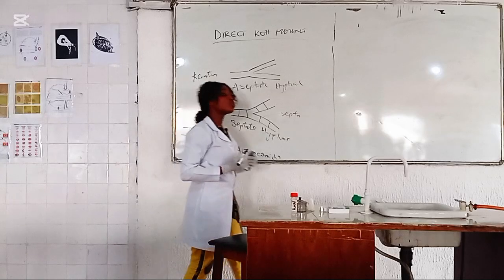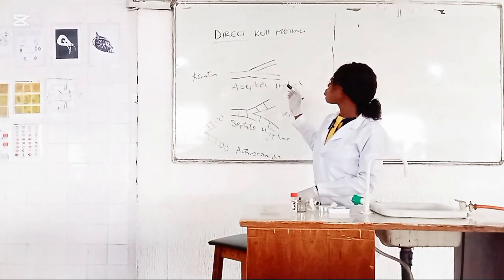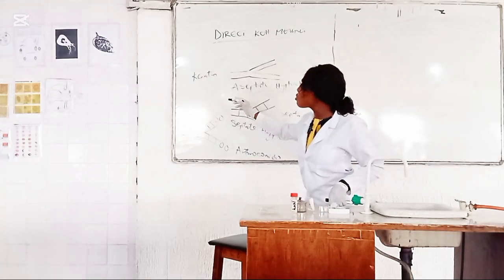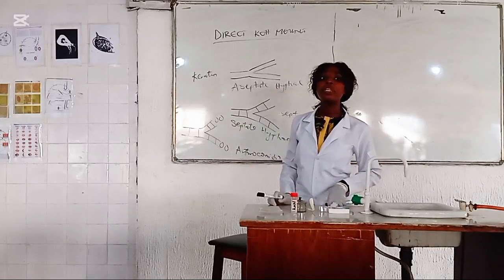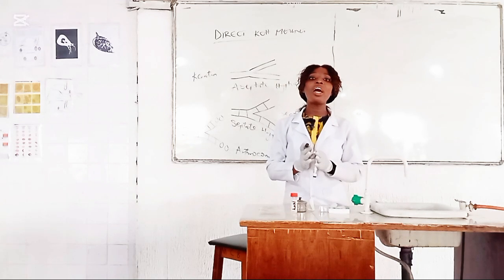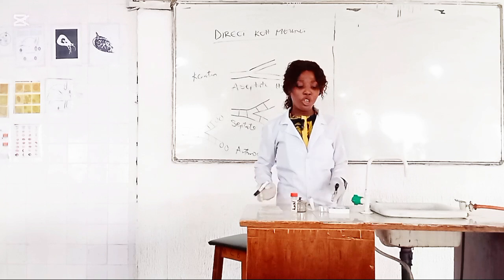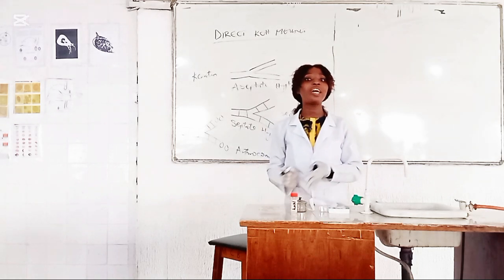For you to be able to view this hair sample under the microscope using KOH, the KOH will have to dissolve the keratinous layer, or the keratin present in the hair sample. So you have to allow a while for the keratin layer to clear off. Usually for hair sample, it takes between 5 to 10 minutes for the keratin layer to clear off.